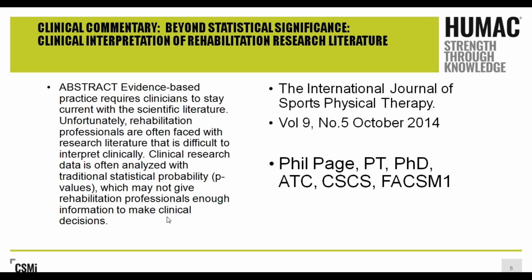And I keep hearing this, that isokinetics is not functional. Well, what I'm going to tell you is that isokinetics can be very functional if you know how to use it correctly. The problem is most people use it incorrectly. So let's go back to some of our basics. What's isokinetics? We already know it's constant speed accommodating resistance. So what does that really mean?